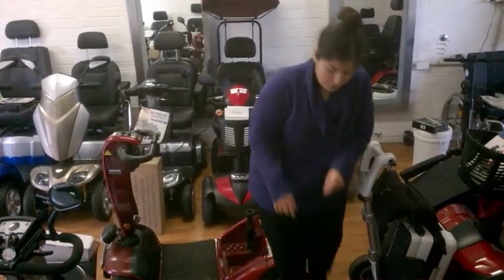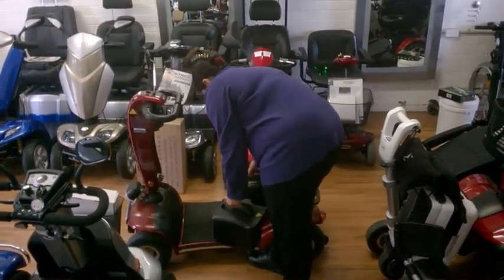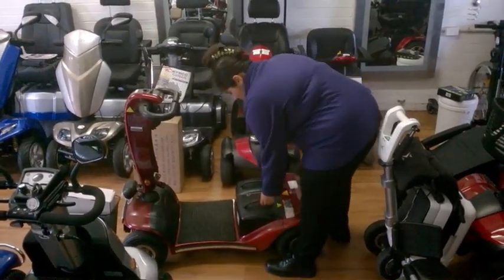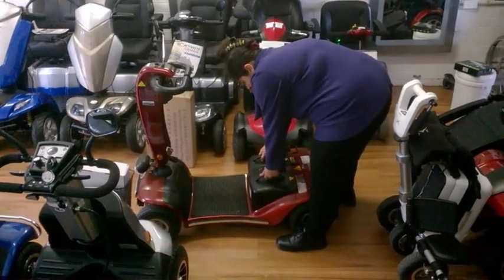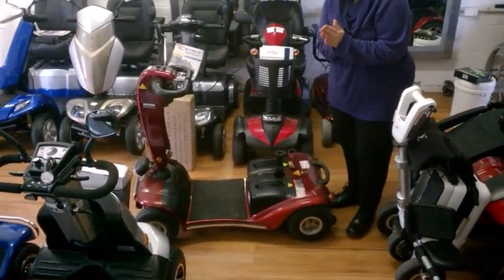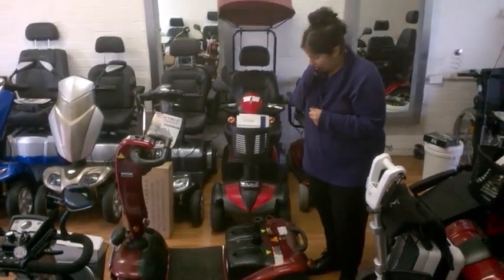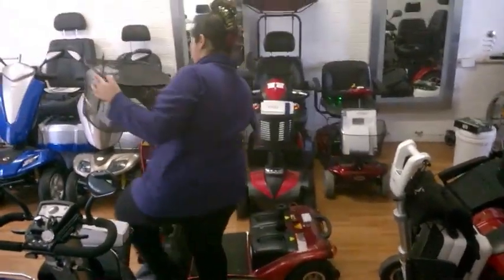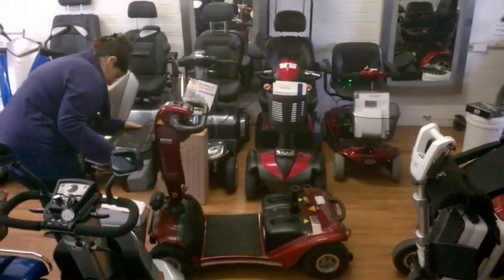The next step is to put the batteries back in, one at a time. Make sure they're sitting nicely together and lying flat — if they're not together properly you won't get proper power. Then get the basket back on, just like this.